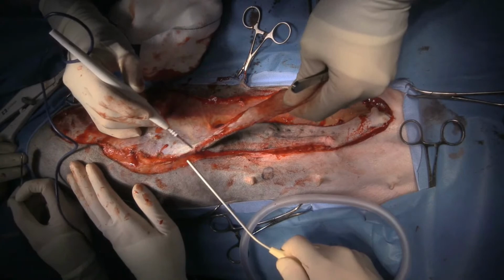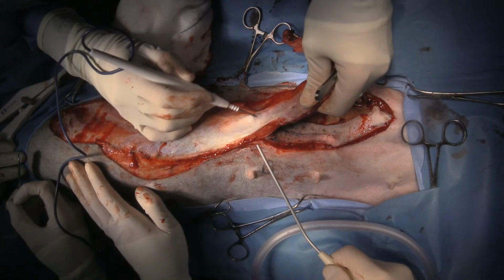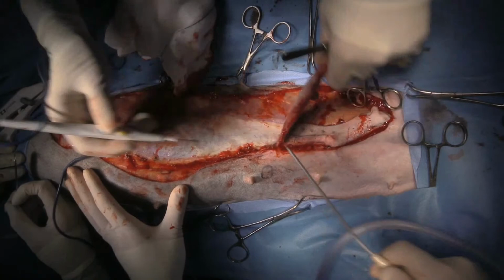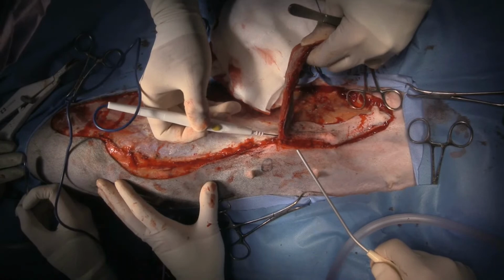What did you guys use in the Humane Society? Well, we had all of the cats, so right. We haven't actually done the dogs yet. Like 2.0 or 3.0, right. Maybe. So my 2.0 was adequate. Yeah. You can see here the blood vessel that's going down the middle here. So that's the caudal superficial epigastric, which is what you'd use if you're using this as an axial pattern flap.